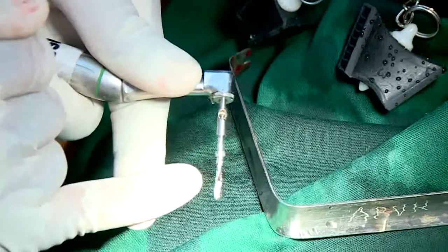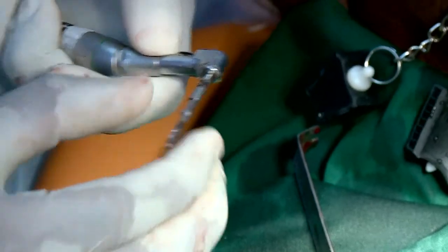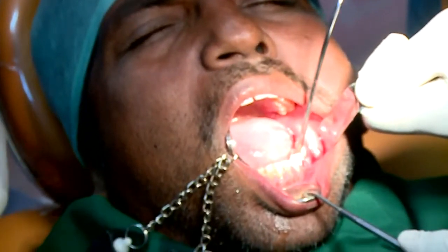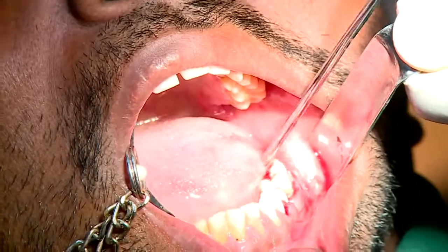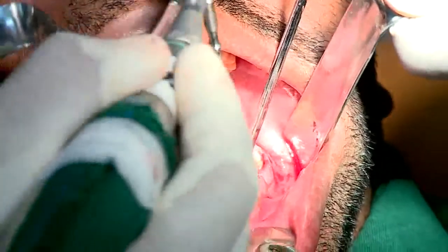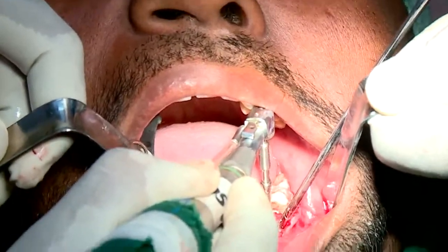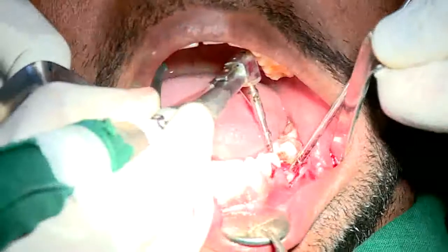Yes, we can see it. At this point, I want to say that there are a few companies like Noble who have a drill which is length determined. In this, you don't have a stopper, so you should see the marking always to stop where you want. If you're going to put a 7.5 mm length implant, you have to stop exactly over there or a little more. But some companies like Noble, or a lot of companies, have a length determined drill. That means there is a stop. 7.5 mm means there is exactly a 7.5 mm drill. You can stop, and there is a stopper, the drill won't go after that. Right?